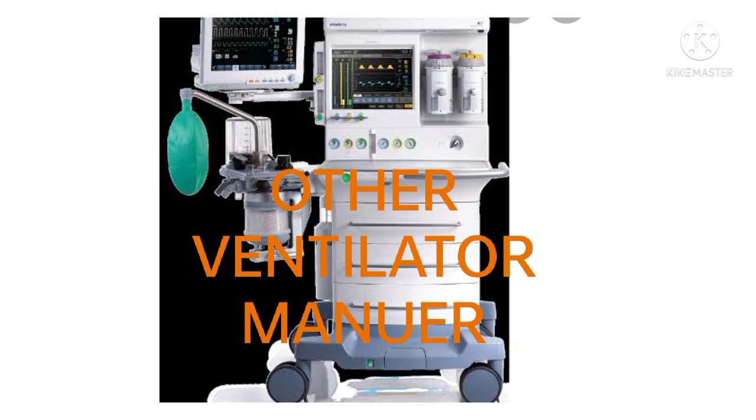Lung volume during expiration and between breaths is higher than normal with PEEP. This increases functional residual capacity, FRC, and often improves oxygenation with restoration of lung volume that normally remains at the end of the passive exhalation. The mechanisms by which PEEP increases FRC and oxygenation include increased aeration of patent alveoli, aeration of previously collapsed alveoli, and prevention of alveolar collapse throughout the respiratory cycle.